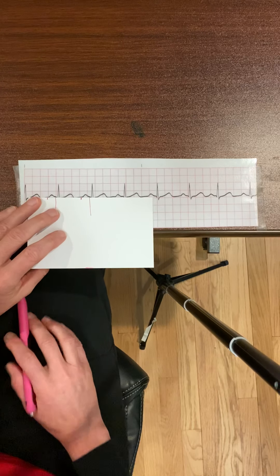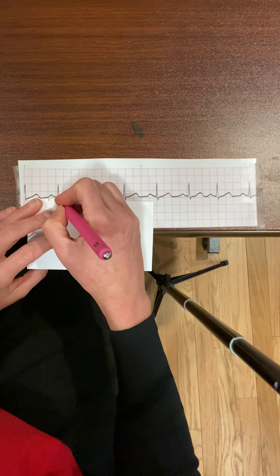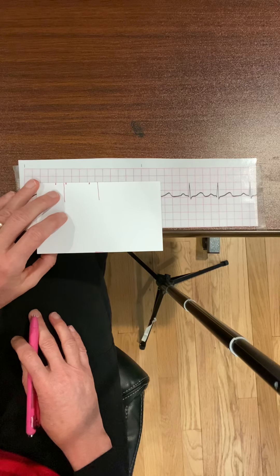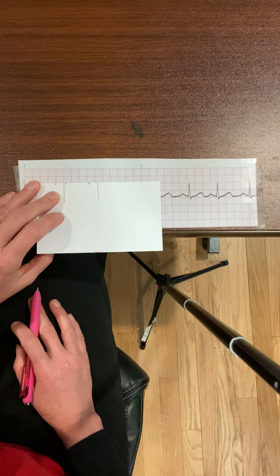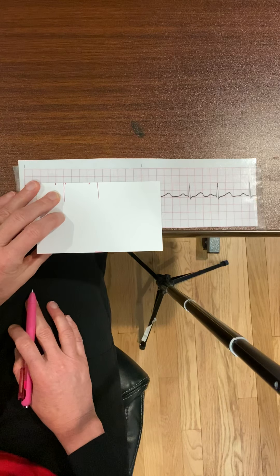The next thing I need to measure is the QRS complex. I put a little line at the end of my QRS, then line up the beginning of my QRS on a big box line. This QRS is two little boxes, so that's 0.08 seconds, which is within normal range.